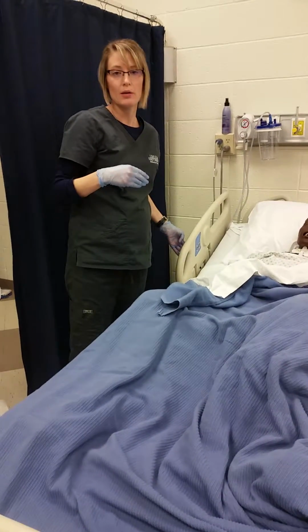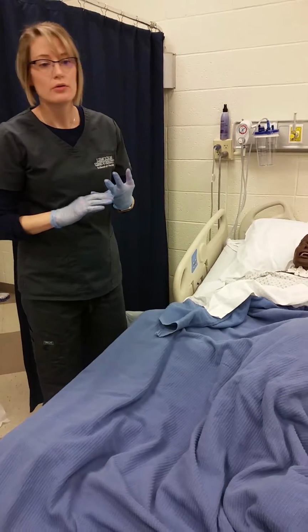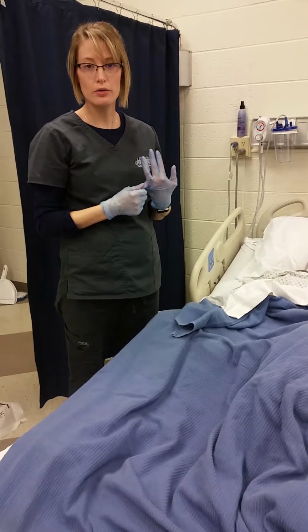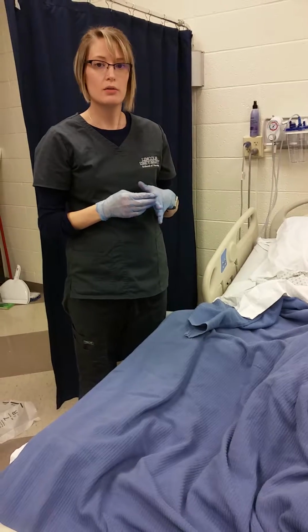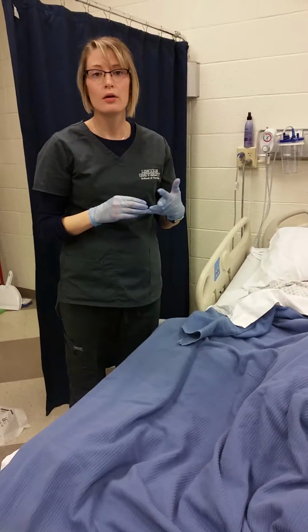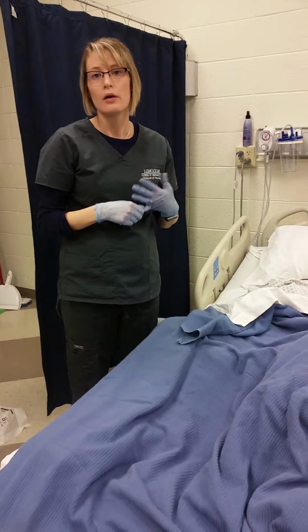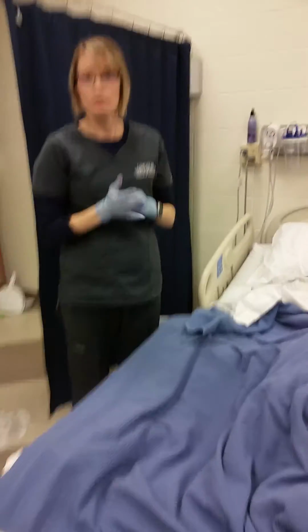And then once I'm done, I'm going to go out and document the date, the time, the size of the catheter used, how well he tolerated the procedure, and then I also want to document the urine color, if there was any urine odor, blood in the urine, or any turbidity, so whether it was cloudy or clear, and that's it.